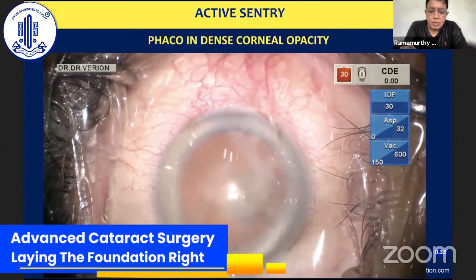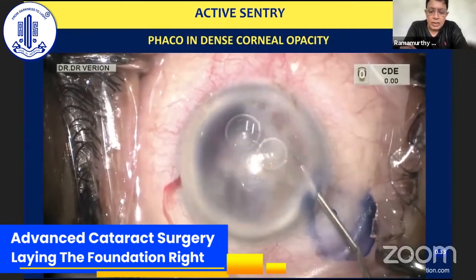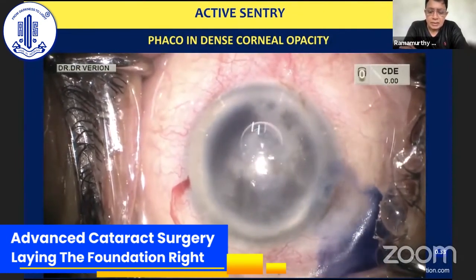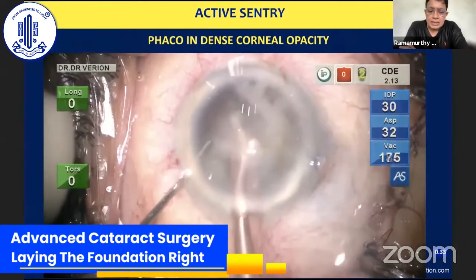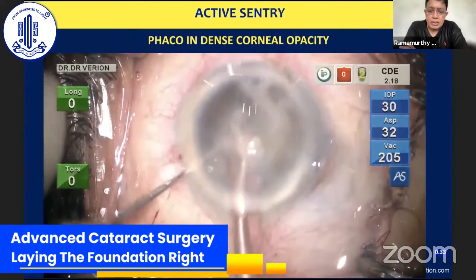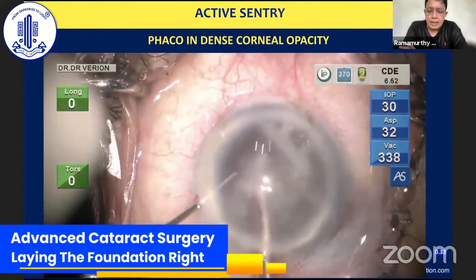This was a significant corneal stromal opacity that was there. Actually, we were planning on using a chandelier illumination system, but because of the red glow that was there, we dropped the idea. But once I stained, and when it came to nucleus emulsification, you can see the corneal opacity is significantly impacting the viewing.